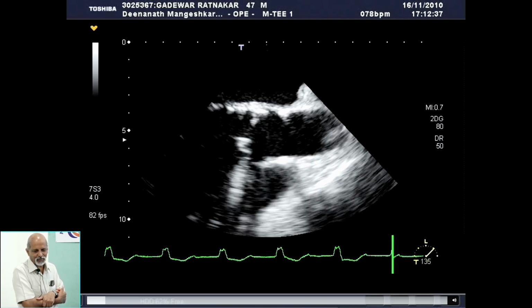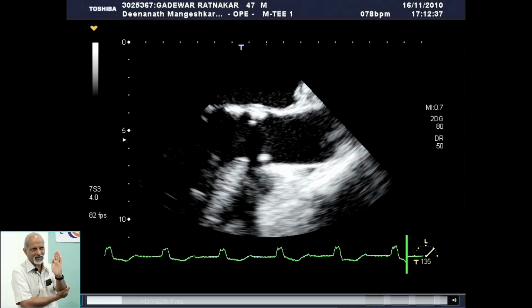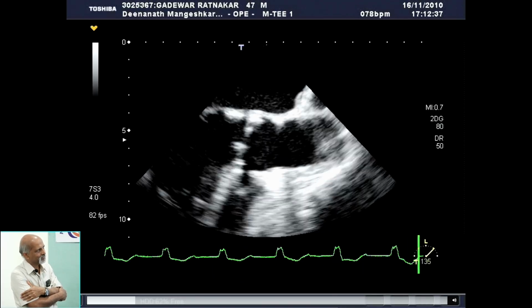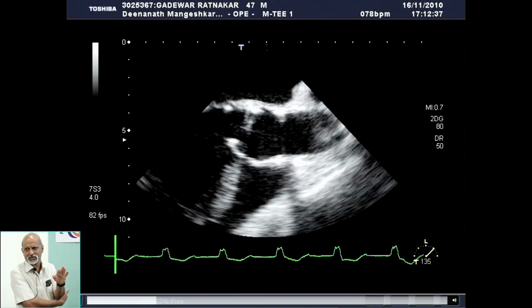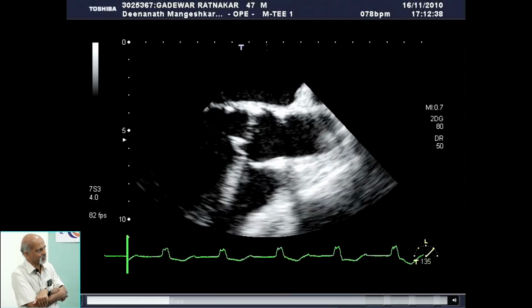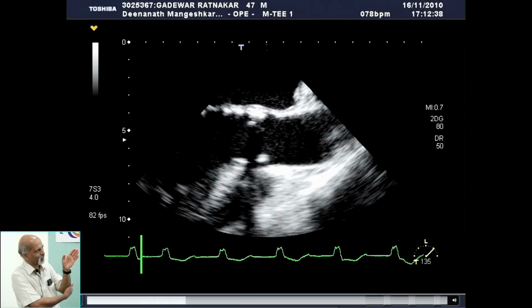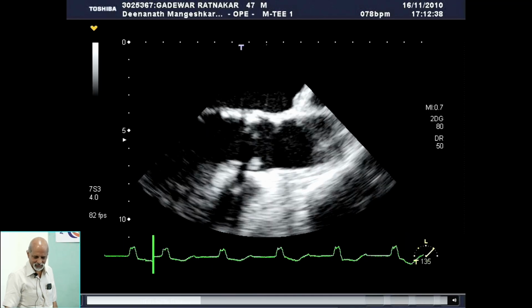If you look at the same thing, again the annulus of the aortic valve, and what is happening with the leaflets, the cooptation point. The same applies as in mitral regurgitation. So in the initial phase you will see it is the right cusp which is going down definitely, but as it progresses, probably you can see the cooptation point itself has shifted a little bit down.